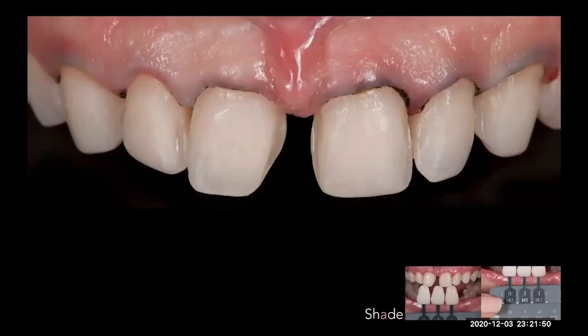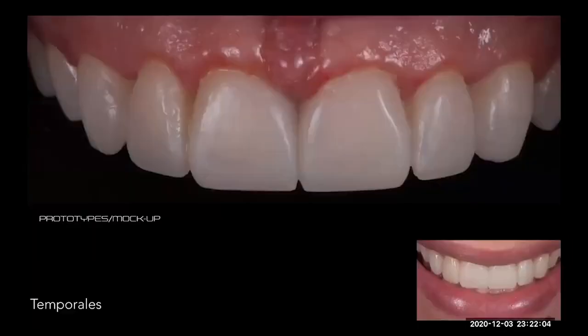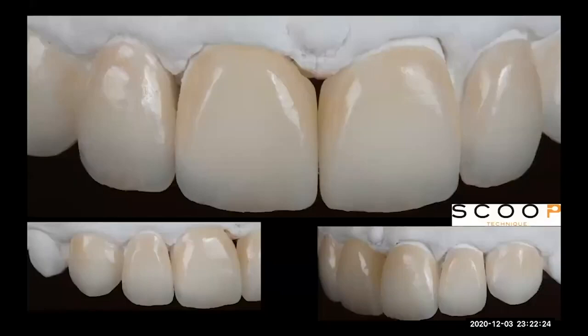Then he gave me the stump shade information that is really important when we use translucent materials. Then they did the wax-up in Venezuela, and from there we did the mock-up. Okay, we did the mock-up. And then we wax, press everything, and then we start finishing our crowns. You see, I did the buildup with different ceramics, different colors to create a 3D effect in the incisal edge. And this is the case finished in our solid model. You can see the movement, the colors in the incisal part.